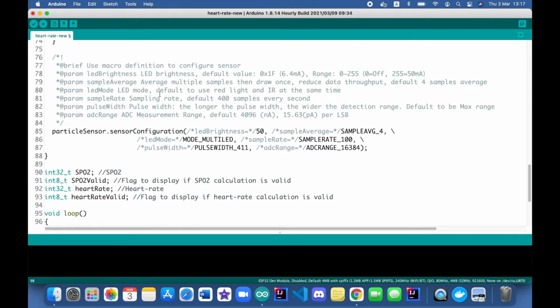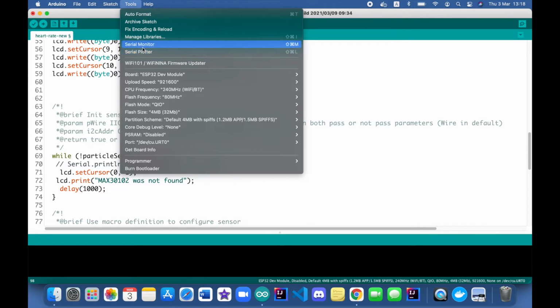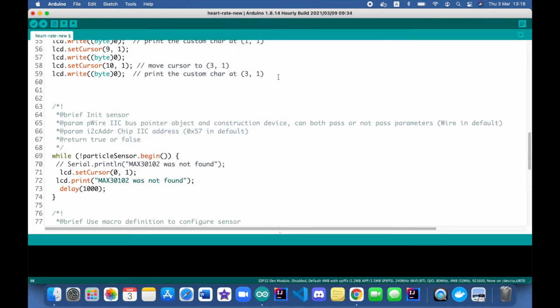serial monitor. In my case, I ran it on Linux. Right now I'm just running it on Mac because it's easier to edit the video later on. But the demo video that I showed you was running on a Linux stationary computer. Even in that one, serial and LCD don't work together, so it's better to just use LCD or serial monitor. Also, you can't keep these two tools open together. So either you use serial monitor or serial plotter.